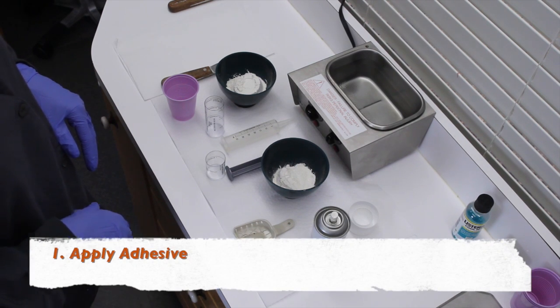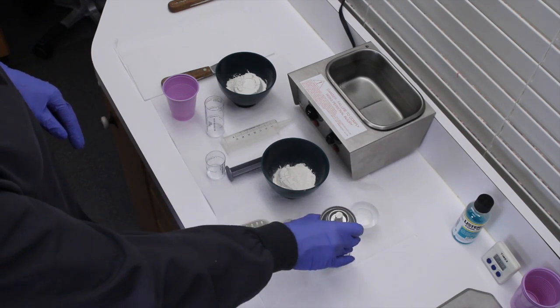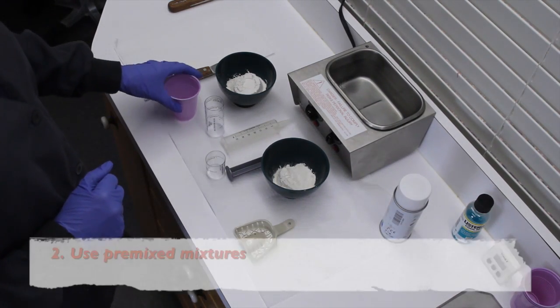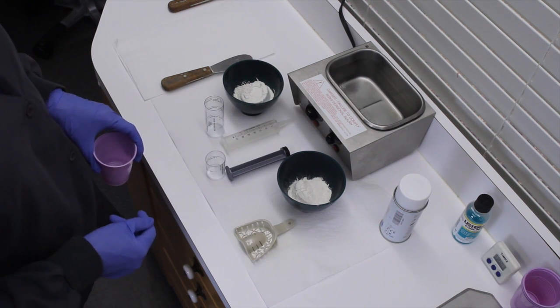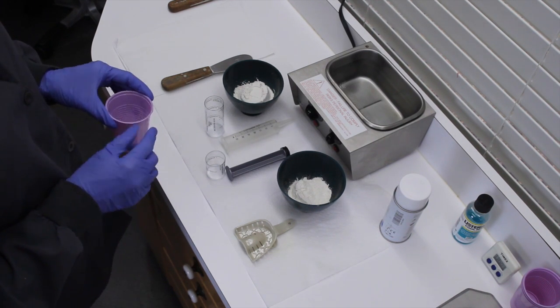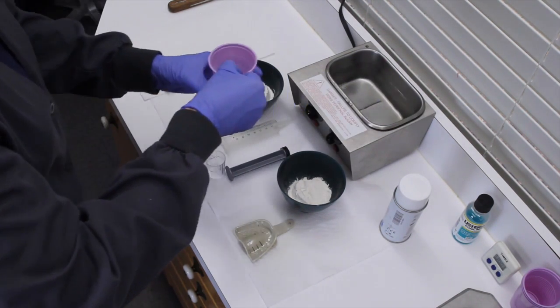Now the first thing, as we described earlier, we're going to want to apply adhesive to the tray. And that is to assure that we don't have any separation of the alginate from the tray during the removal of the impression. Next, we have already pre-measured our powder, our alginate mixtures for the low viscosity and the high viscosities. And we have in the back, which you may or may not have, our little water bath, which keeps our water at a consistent 30 degrees centigrade. And again, you can use whatever temperature you want, but we find that that's a nice temperature that gives us a setting time that's very comfortable to work with.